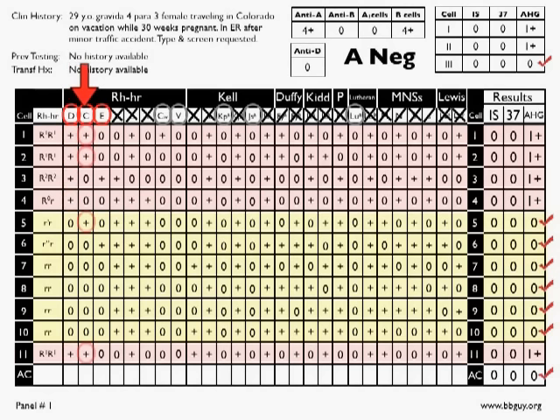Anti-big C doesn't explain all the positive reactions and has one single dose positivity in cell 5 that is non-reactive. So it by itself doesn't explain all the reactions either. Same sort of deal with big E, which is hardly there at all, and doesn't explain all the positives and certainly has one single dose in cell 6 that's negative. So our most likely scenario is that this is an anti-big D.